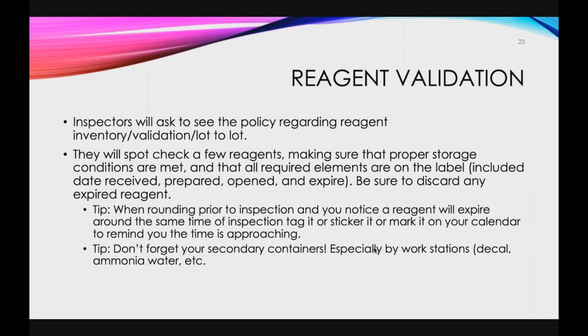And anytime they go in, they know to check it off, and it's just something that they can visually see, like, oh, hey, this is a new lot. I need to make sure that I do this if I have space. And it's easier to not miss when it's right in front of you. If you keep it in a policy book, it's going to be very, very hard for you, especially if you have a heavy immuno antibody list. We have over 100 that we run, and it can get very, very time consuming. But if you have a policy and you have a procedure for doing it, you should be fine.